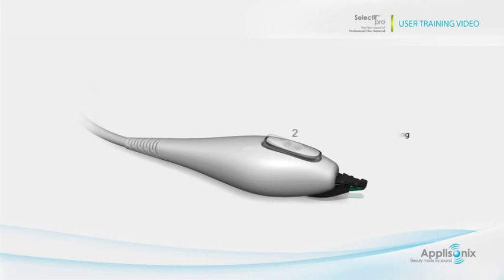Two: to initiate the ultrasonic pulse, press the center. Three: to close the gripping tips and pluck the hair, press the rear. This is optional — for your convenience, the foot pedal can be used instead of the pulse initiation button, number 2, to trigger the pulse.